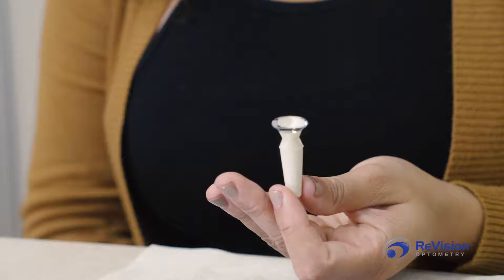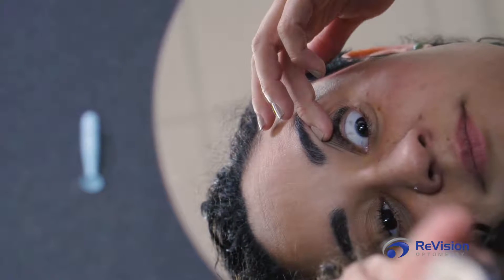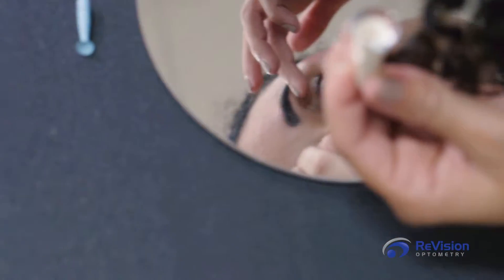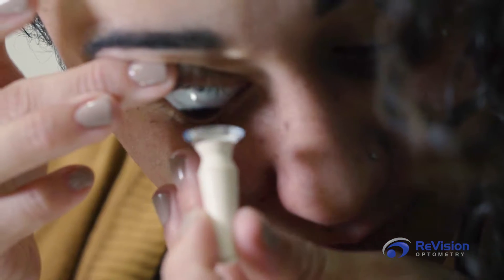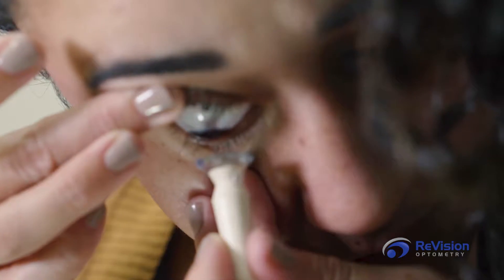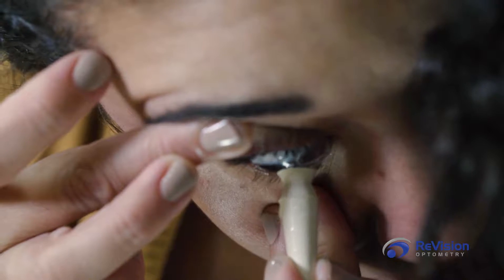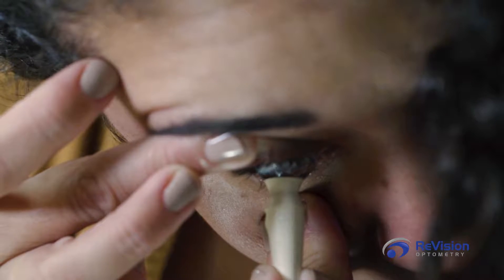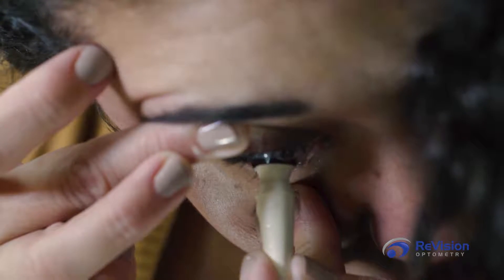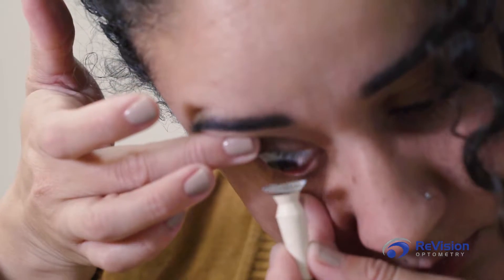Position your head parallel to the flat mirror on the table. Take the hand free of anything in it and pull the upper eyelid open — it is best to hold the eyelid near the lash line to create a wider opening for application. With the hand holding the plunger and scleral, use the fingers available to keep the lower eyelid open near the lash line as well. Keep both eyes open and look straight down into the mirror. Refrain from looking around so you can apply the scleral successfully over the cornea.